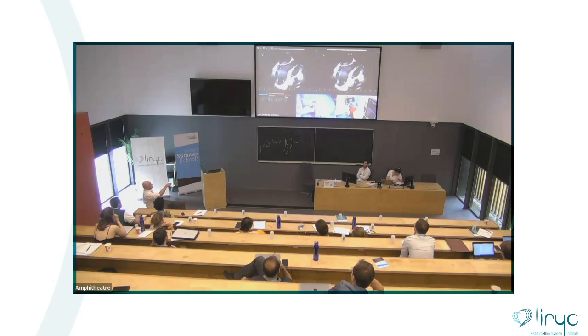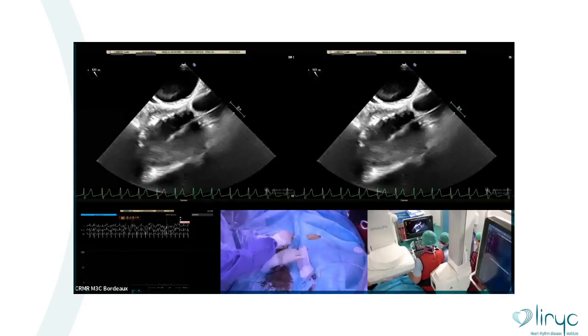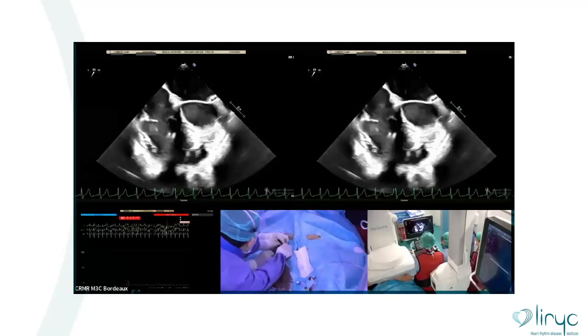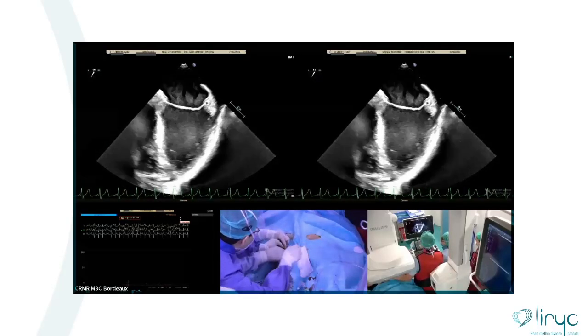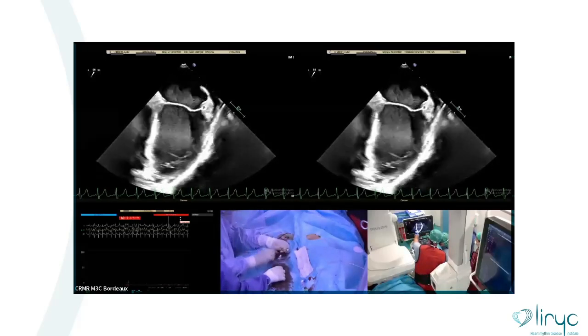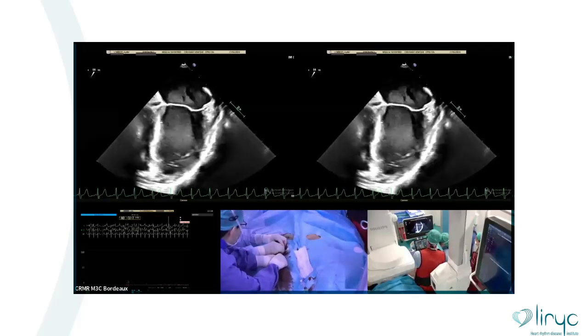So you see here, the sheath without anything in it. You should not check this. So now we're gonna advance the device and lock. You should start and lock. It's not possible. Okay, don't worry, it's okay. We used to do this. You should use a different catheter, a different sheath.